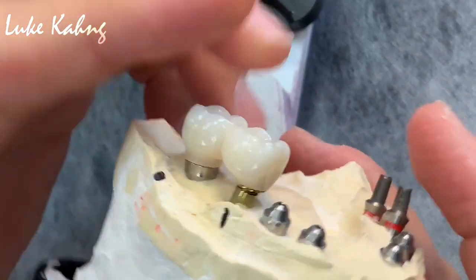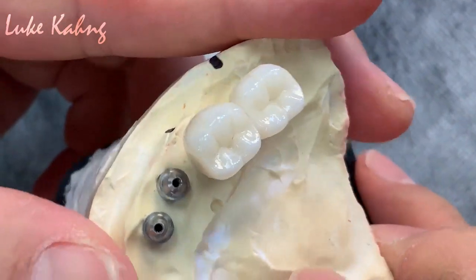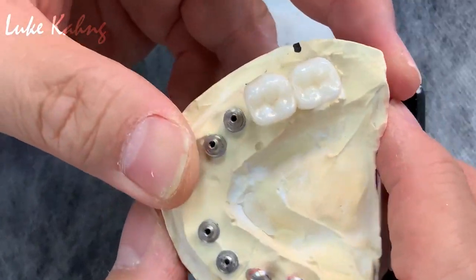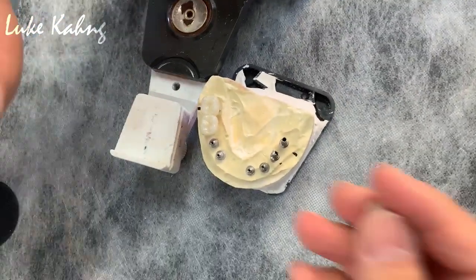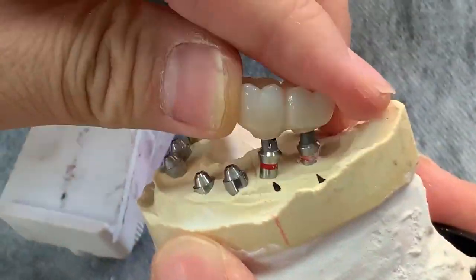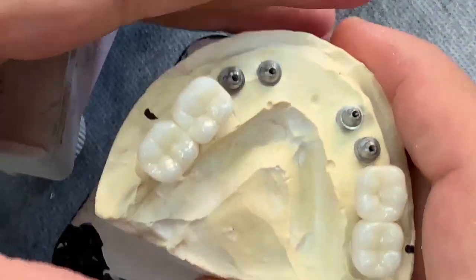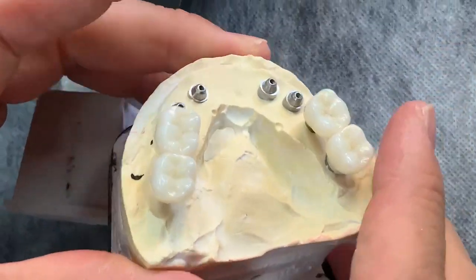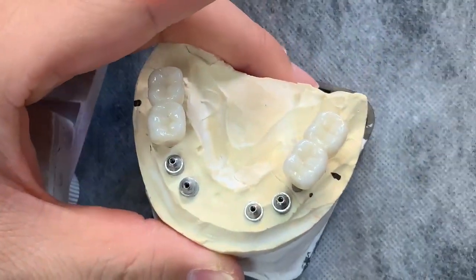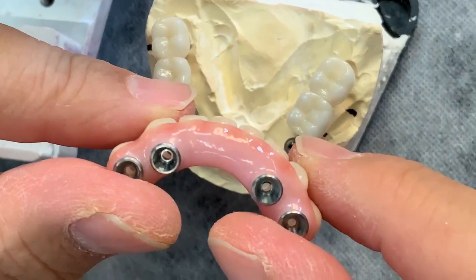Here is a two-crown design which creates exceptional hygiene. So we did not put any pink porcelain underneath — we don't need it. The great anatomy — just like a 30-year-old. The other side is an implant, which is spline. We set up the height contour and the curve of Spee. On top of that, we have a six-unit lower. Making good exceptional hygiene.